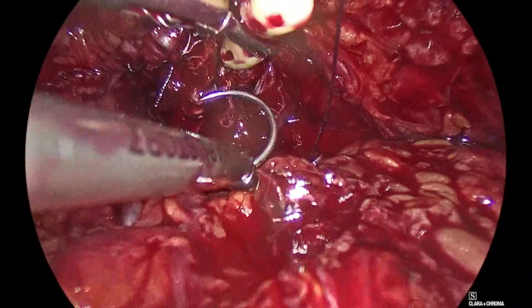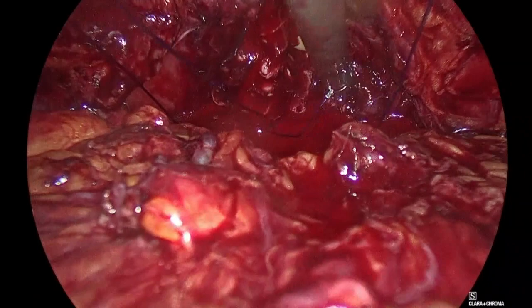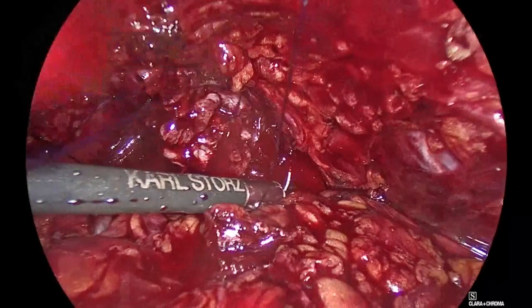Padeli, rotate a bit. Good. So you see you pushing externally there, in the perineum, to put the first two sutures. Okay, good. Go back. Release the tampon. Pull back the catheter in your urethra. Good. Stop. Padeli, to the right.